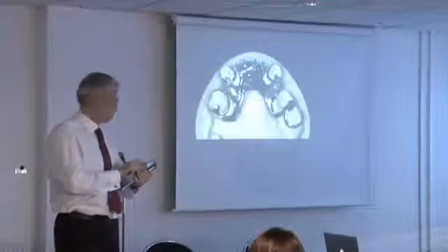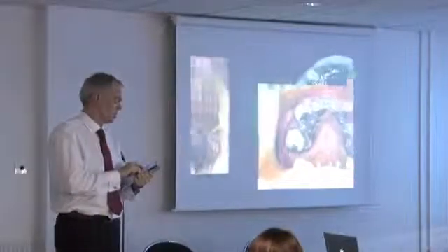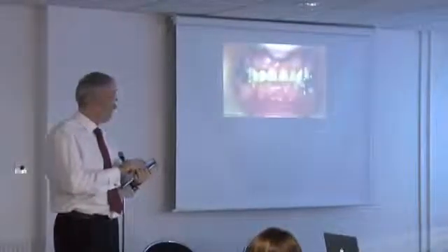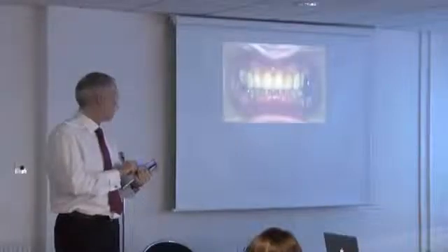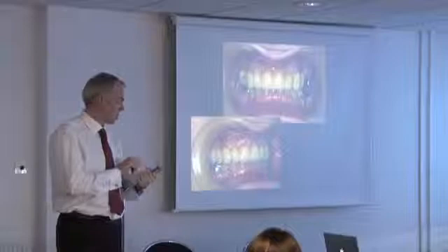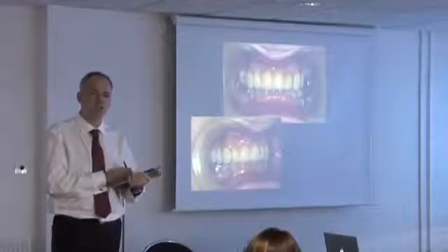We design the denture, and it's all kind of plain sailing from this point, isn't it? We check it fits, nothing unusual. That's where we were. That's where we ended up. Increased the vertical. Changed the situation. I've got a little bit of a clasp down the bottom corner here, but it's not a clasp that anybody's going to know.